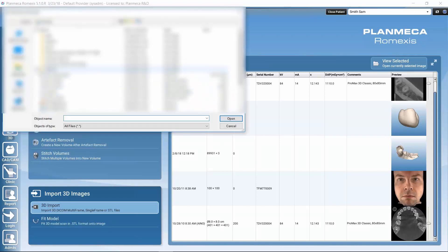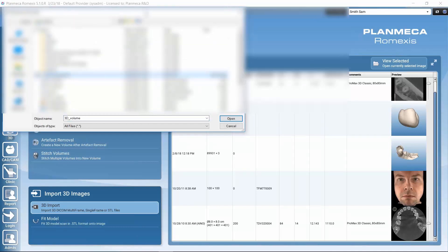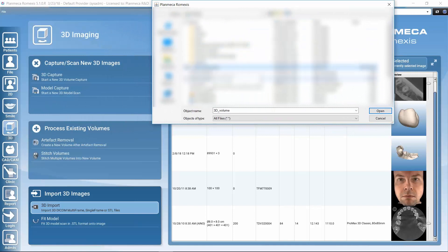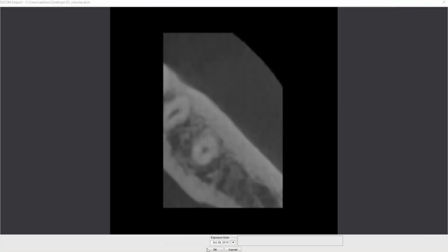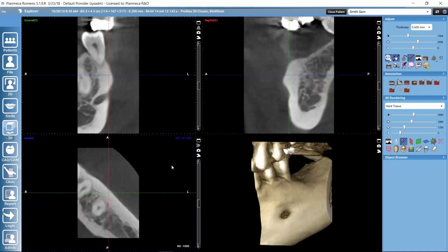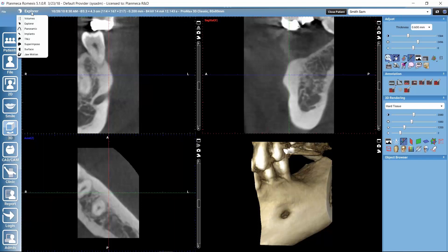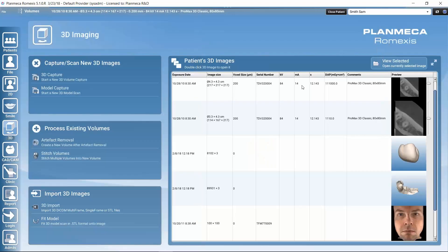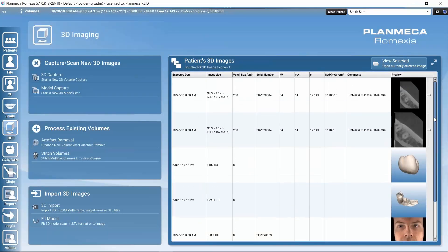Let's actually just import a 3D volume. I select this DICOM file and click OK. This one already exists in my database but I will import it anyway. After importing or capturing an image, it gets automatically opened in the Explorer submodule. We can get back to the volumes list by clicking on Explorer and going to Volumes. Now we see that we have the same volume — the one I imported was previously exported from the same patient — so the patient now has six 3D images in the list.